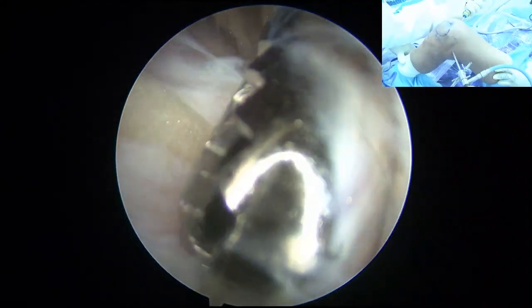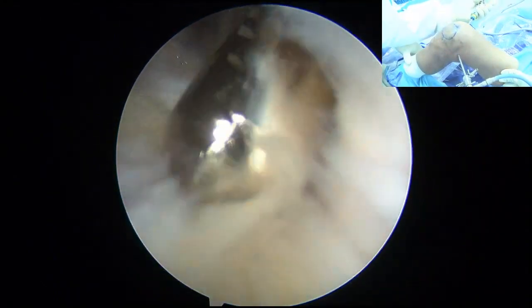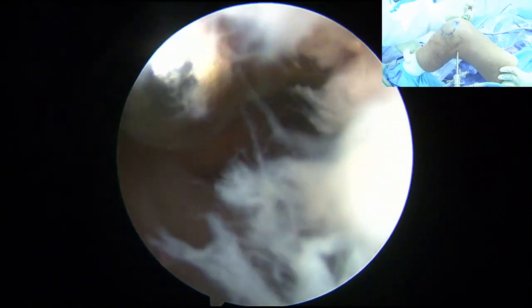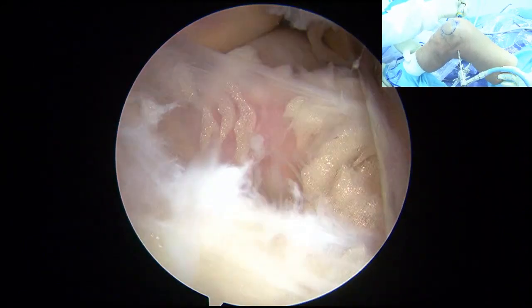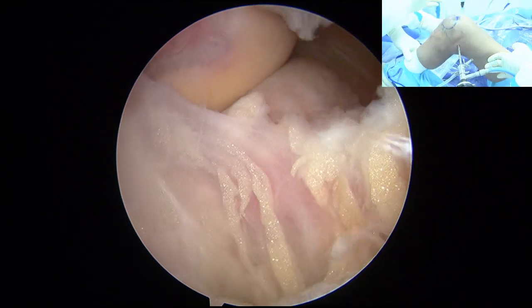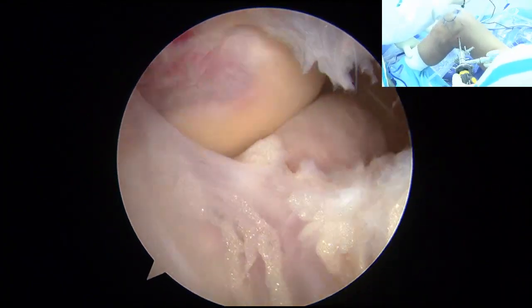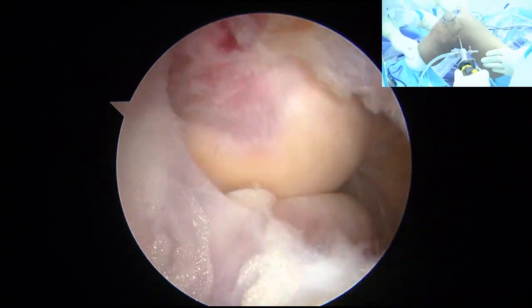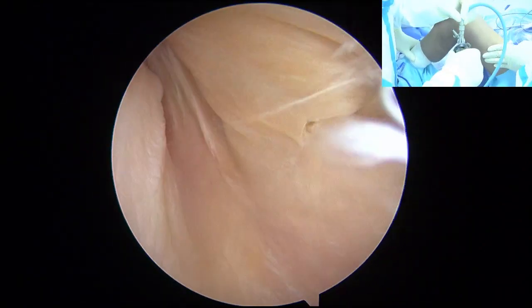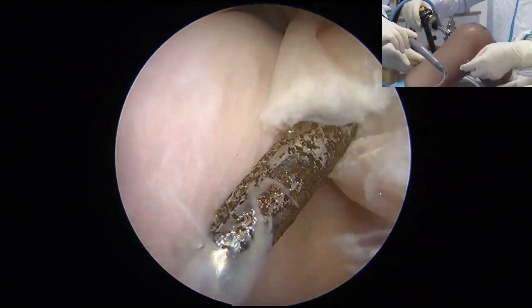We clean until we see the femur, and until we see the tibia. After you clean down here, you can see the PCL stump, okay? Or you can use the RF. But keep in mind, you should keep this track to see the posterior compartment very well. I show you a little bit of the PCL, but I will come back to the ACL. So this is the step of the portal placement. What we just demonstrated was mainly the portal and soft tissue tunnel creation, and we have seen the PCL. Next I will focus on the ACL. All operations must be done inside the soft tissue tunnel.